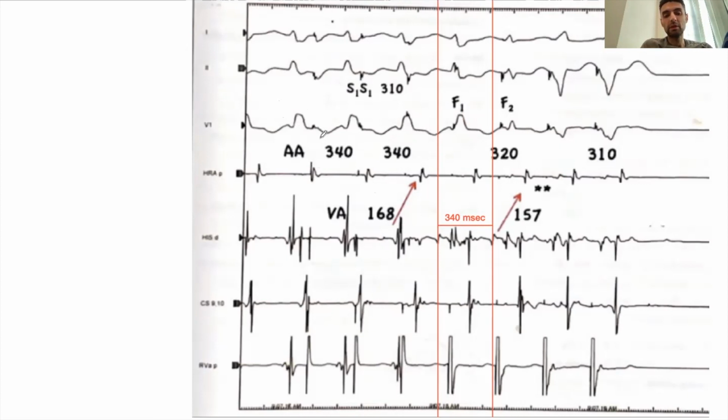And this is the first pacing stimulus. This is the second pacing stimulus without any change in QRS, and it occurred after the QRS by a distance. That's your third pacing stimulus without a change in QRS. That's the fourth pacing stimulus with a definite change in your QRS. So you know this pacing spike actually captured, and it's a narrow, or narrowish, complex beat. So you know it's fusion. This is fusion beat number 1.